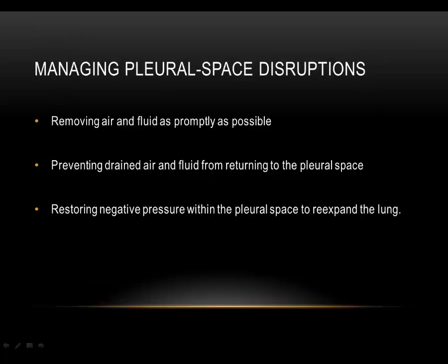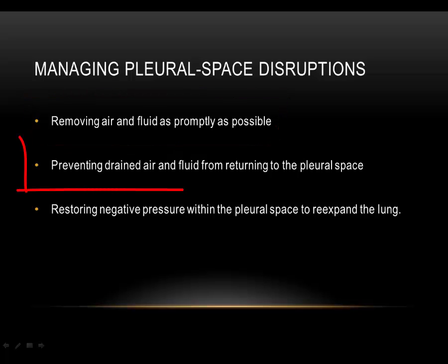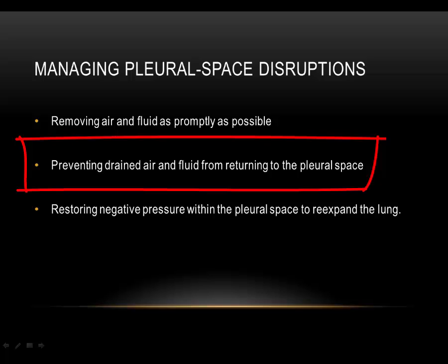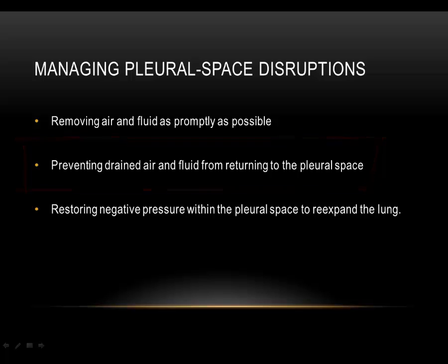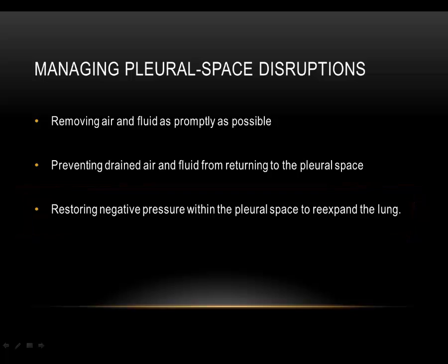The overall goal of chest tube therapy is to promote lung re-expansion, restore adequate oxygenation and ventilation, and prevent complications. For treatment of pleural space disruptions, chest tube therapy should focus on three primary objectives. 1. Removing air and fluid as promptly as possible. 2. Preventing drained air and fluid from returning to the pleural space. And 3. Restoring negative pressure within the pleural space to re-expand the lung.